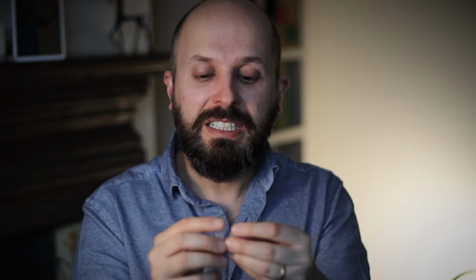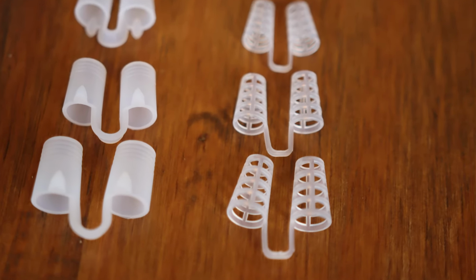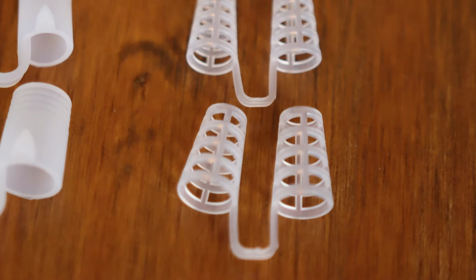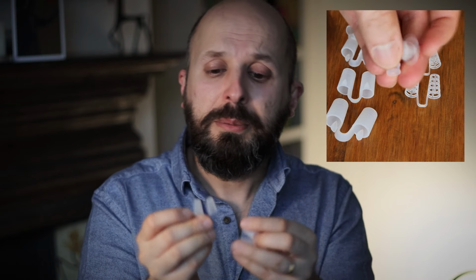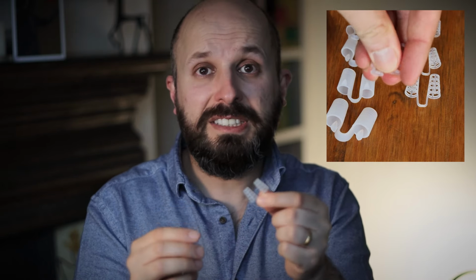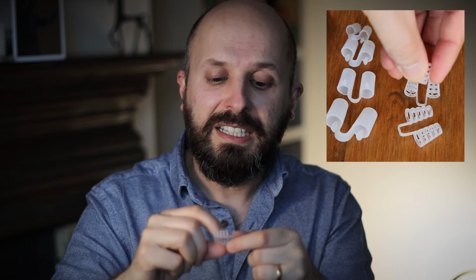Better Sleep ones. These have got these sort of rings or holes in the middle of them, and when you put these up your nose, I'll show you this again, it works quite well. It's not perfect because it doesn't block up your nose quite as much, but a lot of patients say to me once they've used these types that you get a little bit of crust or basically bogey stuck inside here, and that causes sort of an icky sensation. Oh God, that's very disgusting.